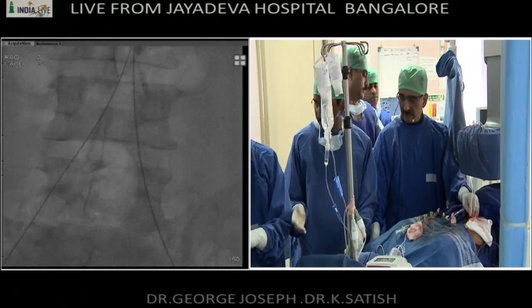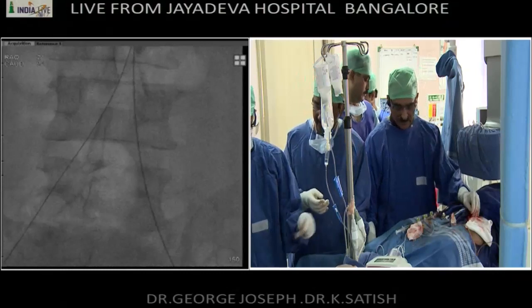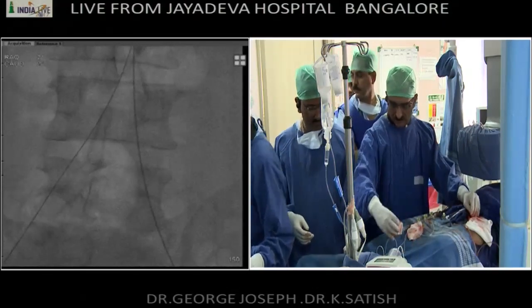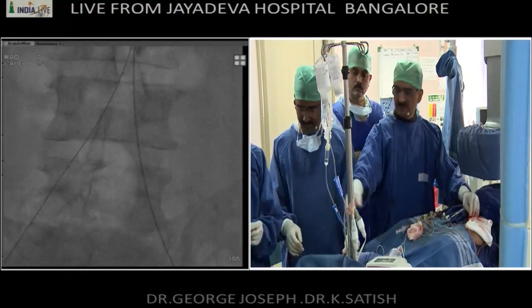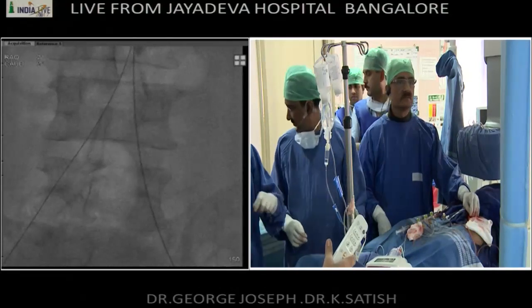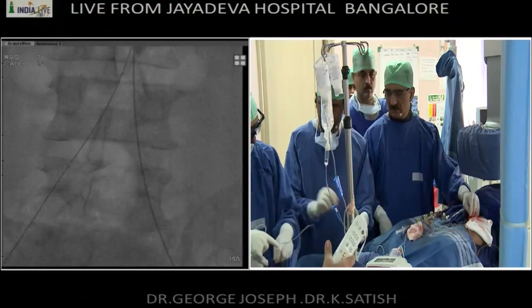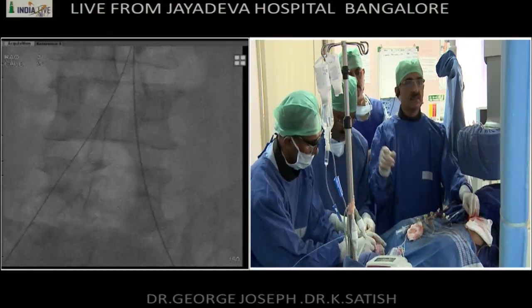Yes, Kanna, did you have something to say? I missed that comment. Any 6-5, anything. We just want to change the wire, that's all. Whatever catheter you have. How much time are we left with? 2 minutes, sir. 10 minutes. We have 10 minutes now. Can you get two 8-58 stents?